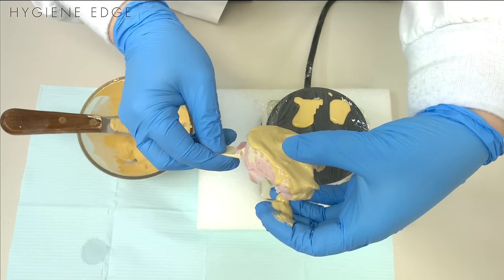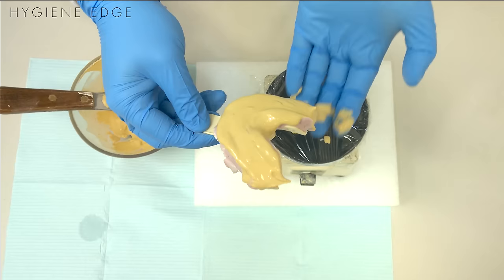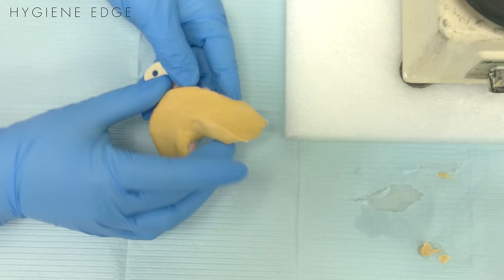If the stone goes around the impression and it dries, it will lock the impression in place and sometimes it's really hard to separate the two. So as you rest it to set, make sure that the stone is not wrapping around the tray.